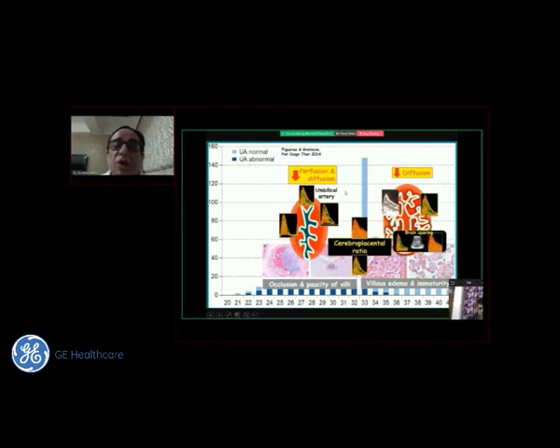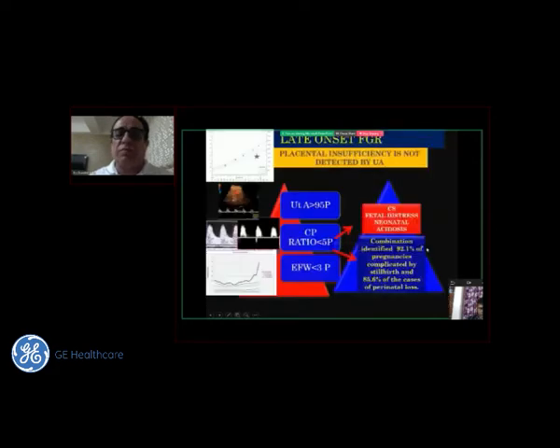hypothesis that in the early part of IUGR, it is both a perfusion and a diffusion defect. This is because of occlusion of the villi or less number of villi or paucity of the villi. In the later part, that is after 32 weeks, the villi are there. They are edematous, they are immature, and if you have a sudden drop of oxygen and if the fetus demand is high, then these fetuses cannot survive. And so it is a diffusion defect, and the cerebroplacental ratio is an all-encompassing factor which can be used in both, but essentially better in the late FGR.